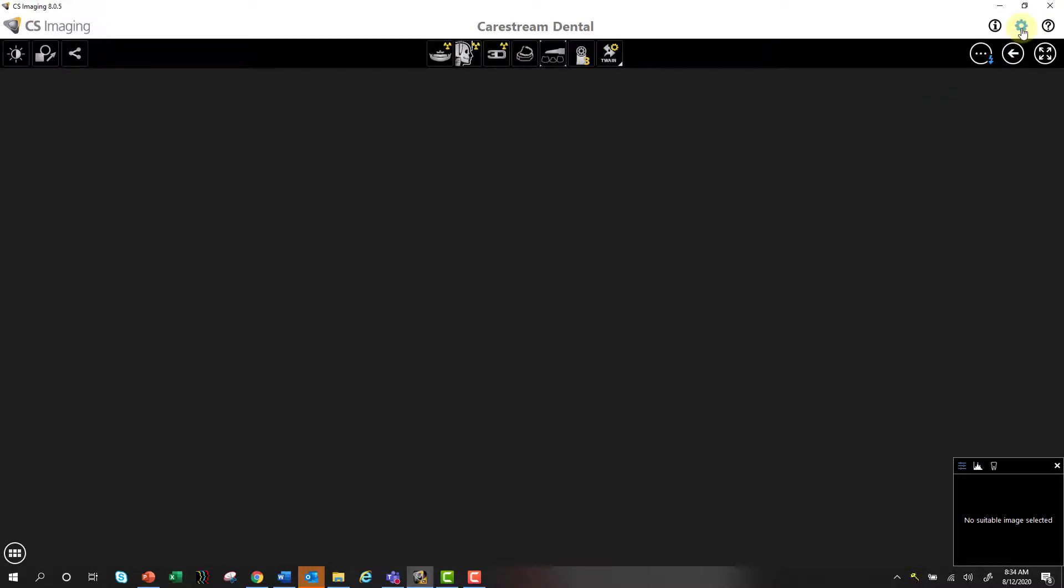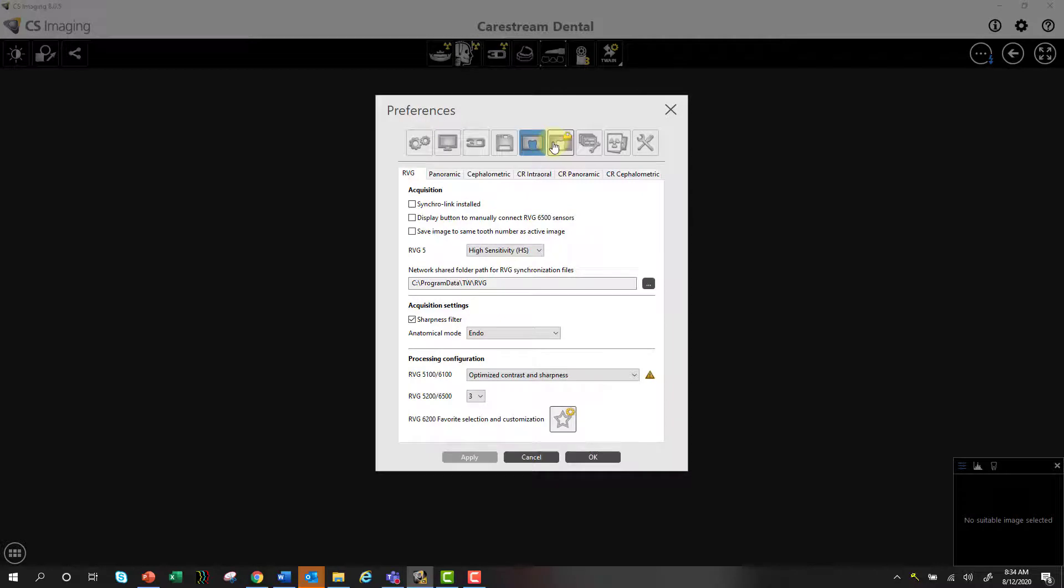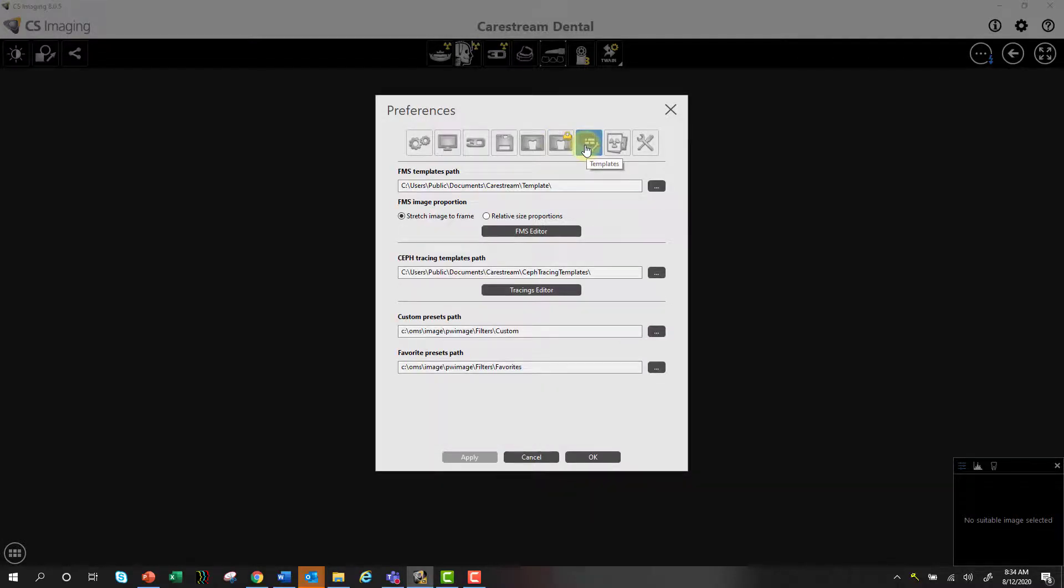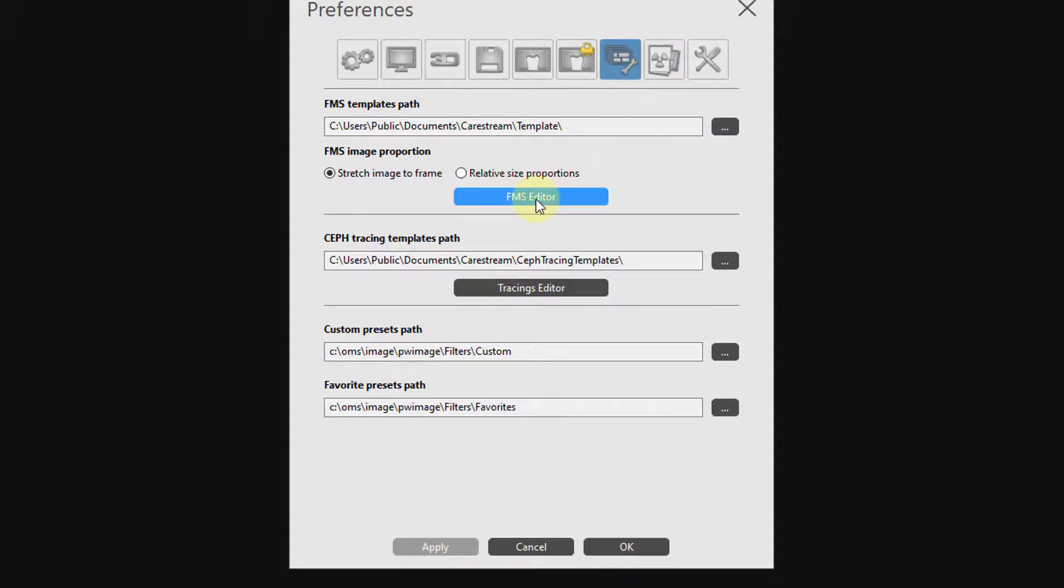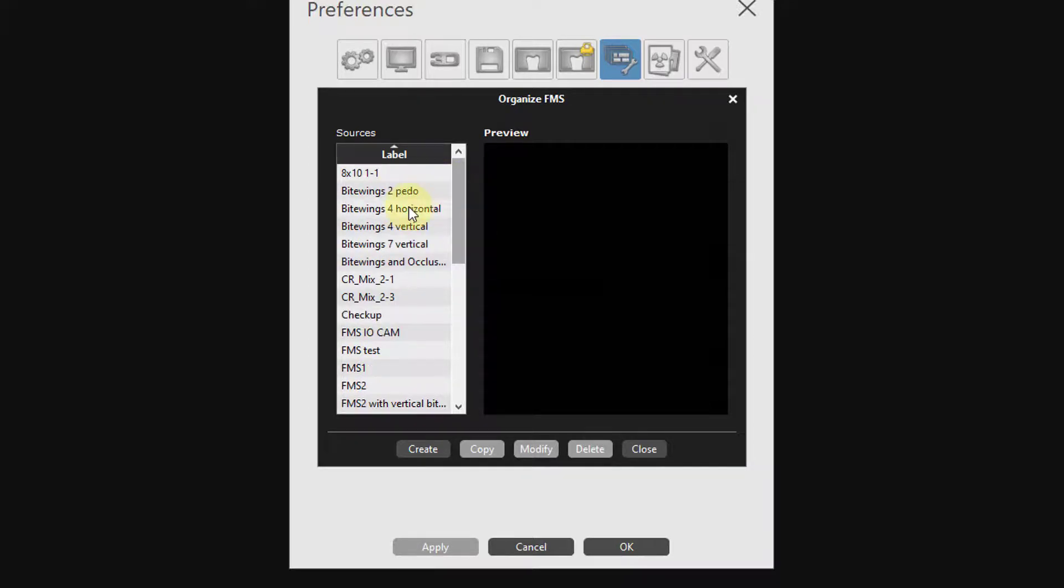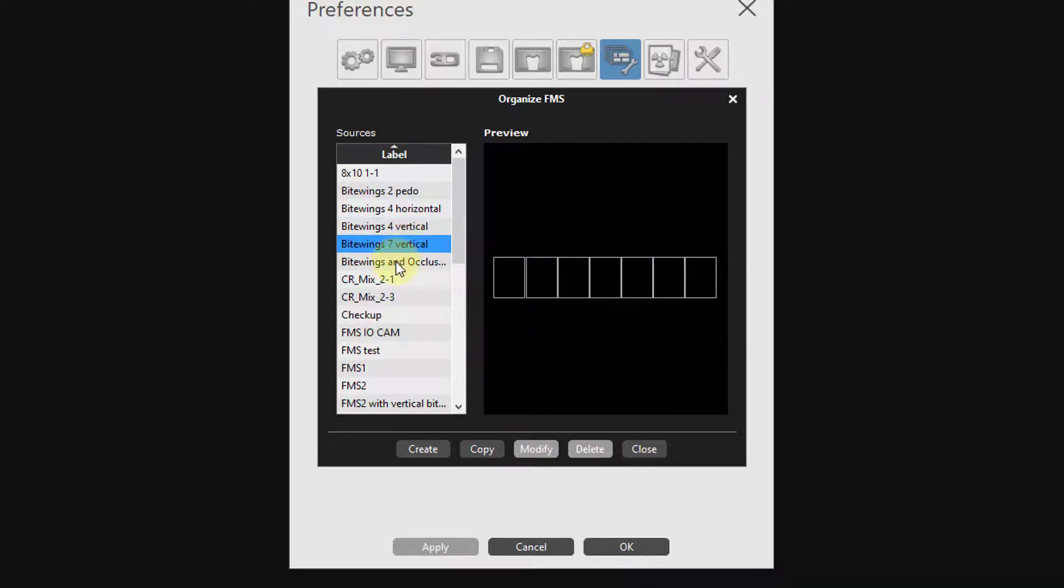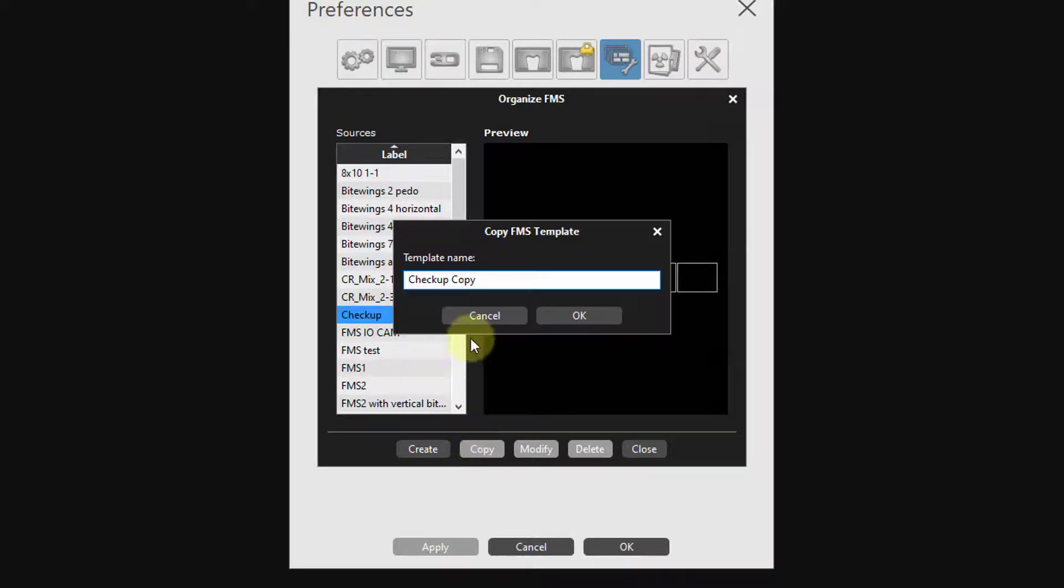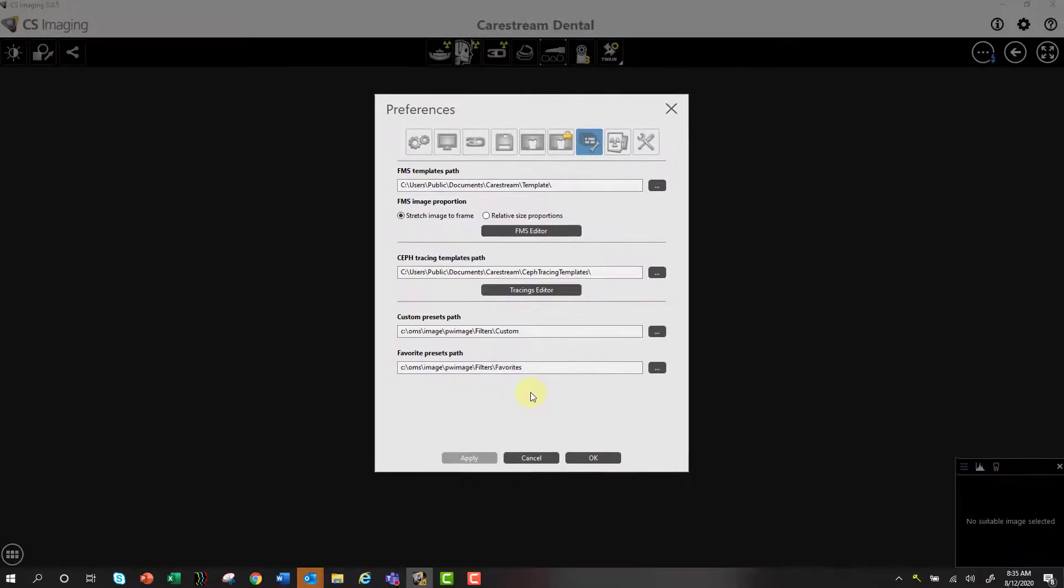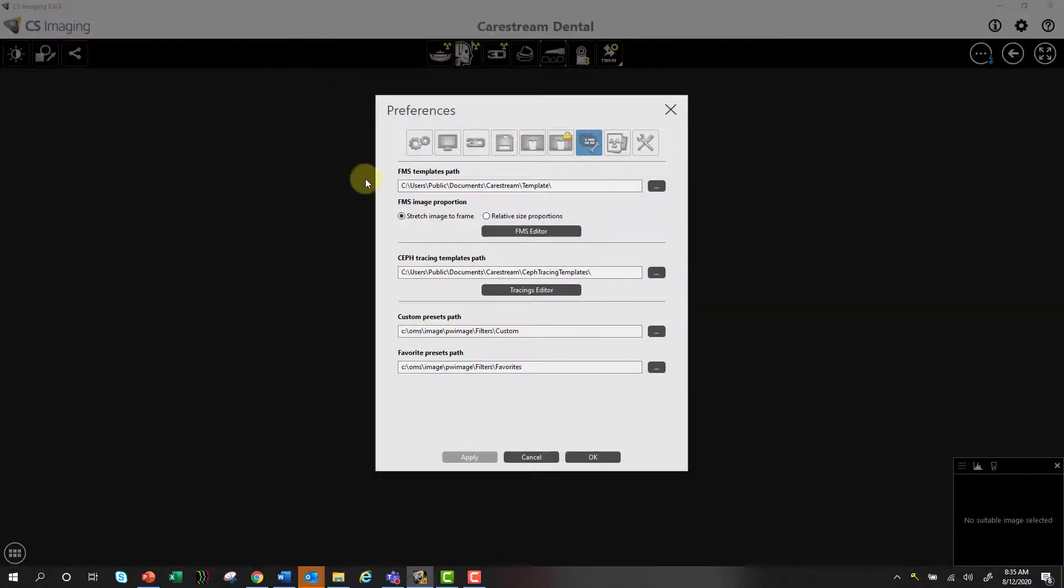Let's continue on in a couple of other options in the preferences. I'm going to cover this one next. So FMS editor. This is actually where you can create and modify your templates now. So we can see here my FMS editor is right here. And I can go into it. And here's all of my default selections or my standard selections that come with the program. Note, down below, you can select modify or delete. You cannot modify or delete the standard templates that come with the program. If you want to modify one of those templates, you must first create a copy of that template. So you can select copy, and then you can actually rename it, and then you can modify that template. So you cannot edit or delete the standard, but you can create a copy and then modify those.